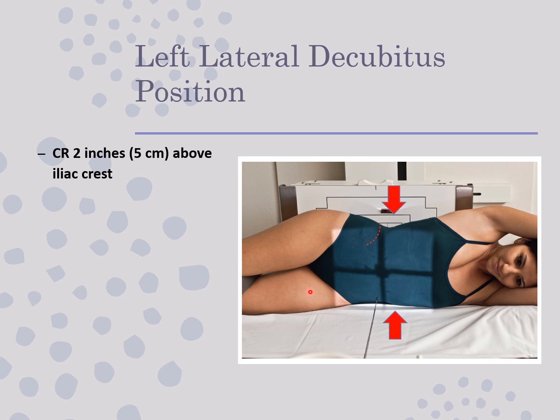And notice when you read this, it says the patient should lie on their left side. They do reference a minimum of 5 minutes. But the central ray should be at 2 inches above iliac crest and midline. So I gave you these arrows. That is where this line should be, in between these arrows, 2 inches above her crest at midline.